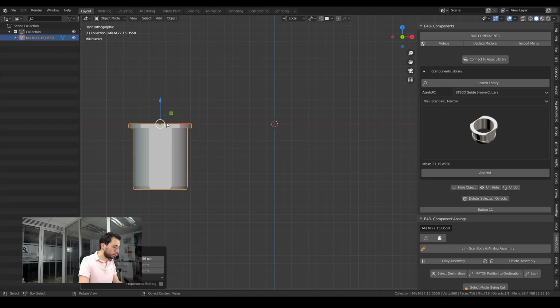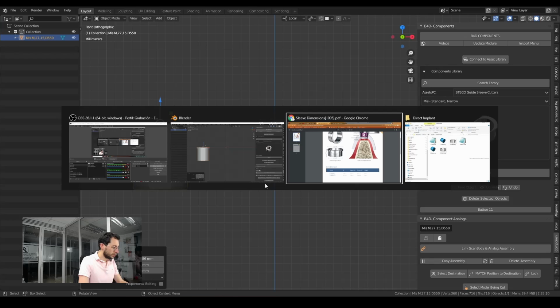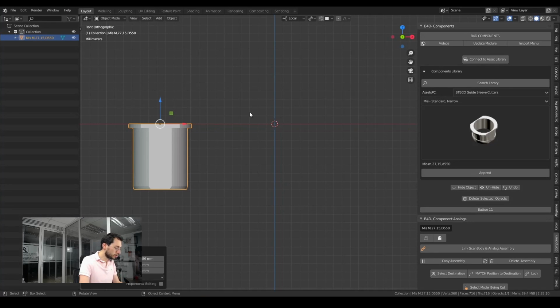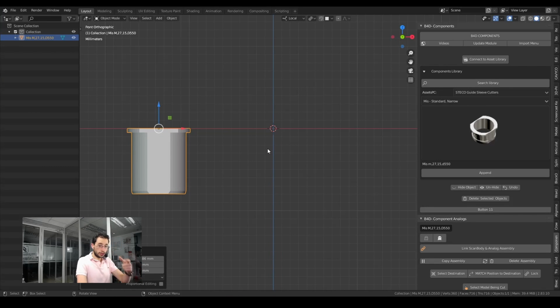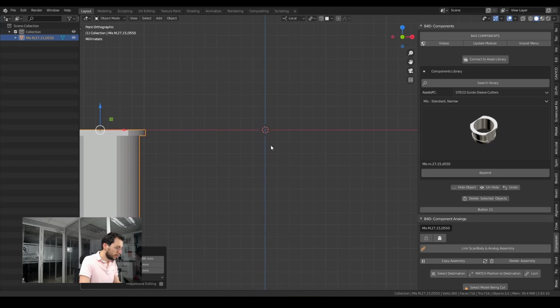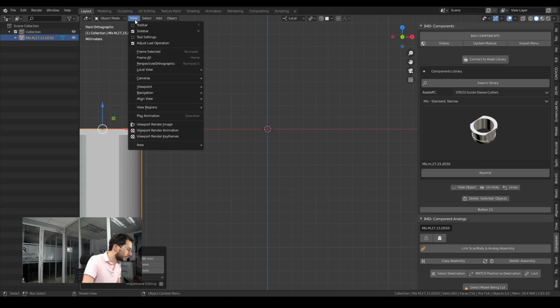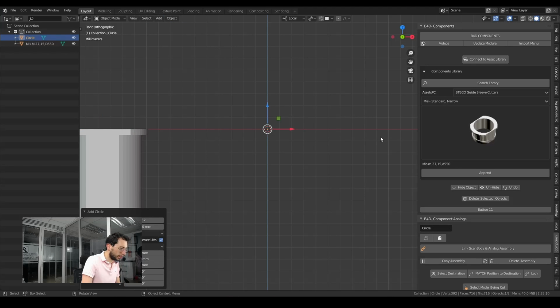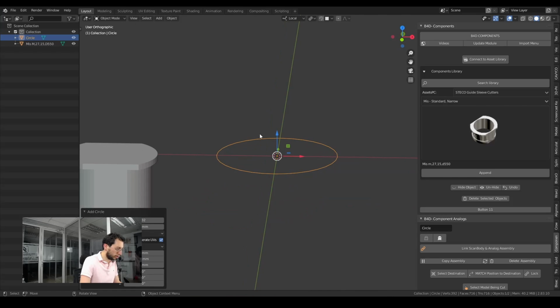So what I'm going to do is exactly the same thing. First, since I have here some dimensions, I can see the upper OD, upper diameter, is 6.68 millimeters, okay? So I will add a small circle here in the middle of the scene with exactly those dimensions, okay? In order to do it, I press add, mesh, and circle, okay? And now I get a circle, but with a radius of 1000 millimeters, which is huge. If I press, let's say, 5, I will get something like so.